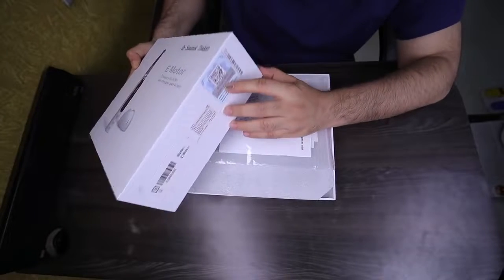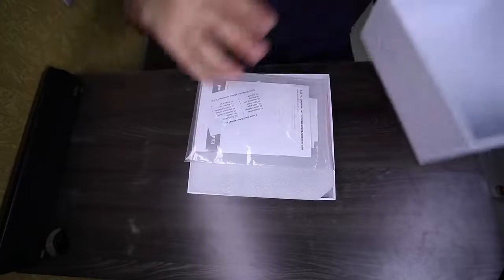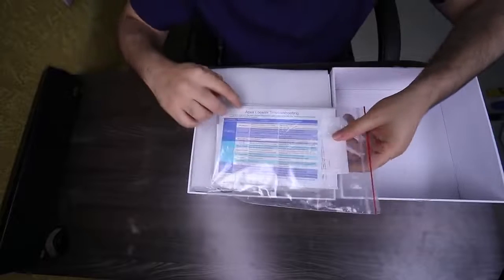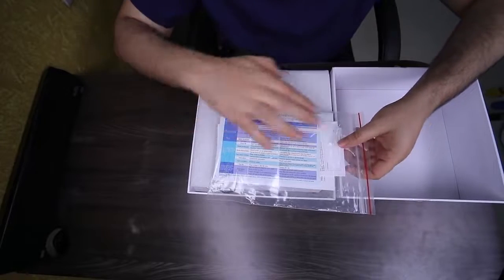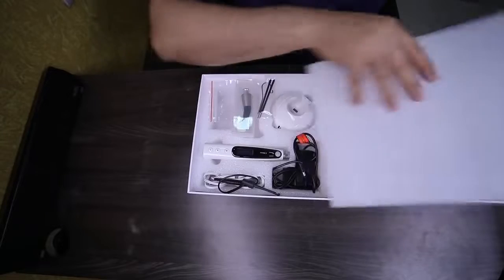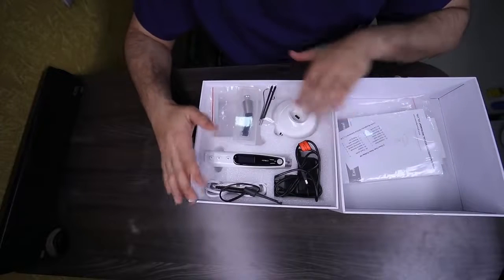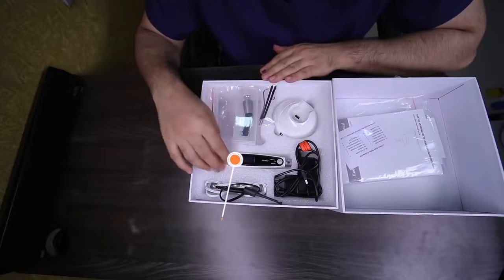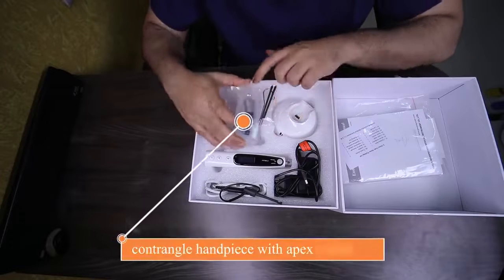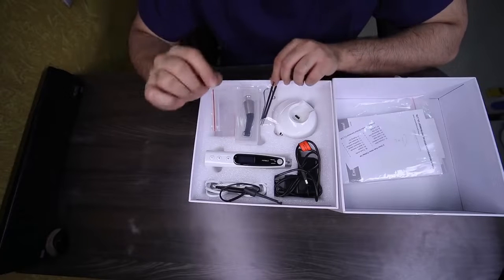There is an authenticity check over here, barcoded to check whether the machine is genuine or not. Inside we have the instruction manual. You have the Apex Locator troubleshooting manual plus a one plus one year of warranty. The packaging list consists of the main motor handpiece and the contra angle with the spray nozzle. The contra angle has an inbuilt Apex Locator with a 6:1 ratio handpiece.